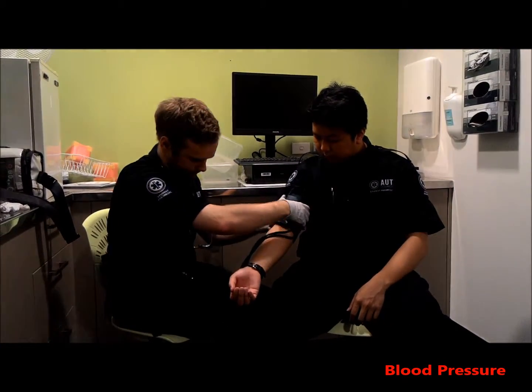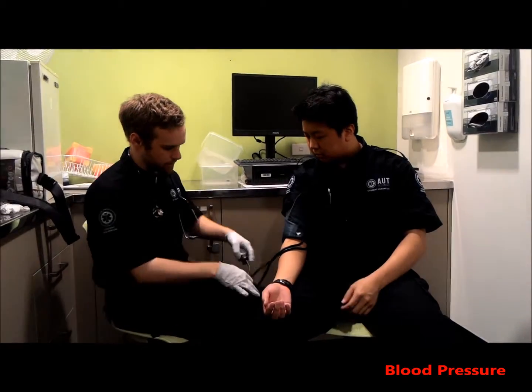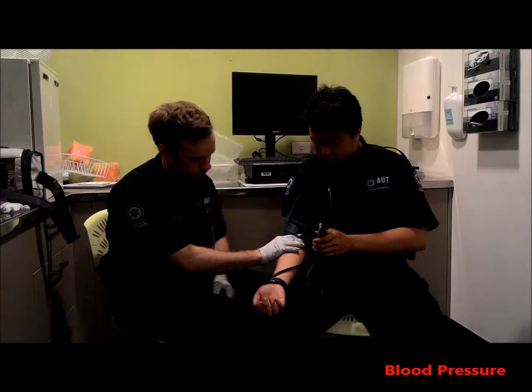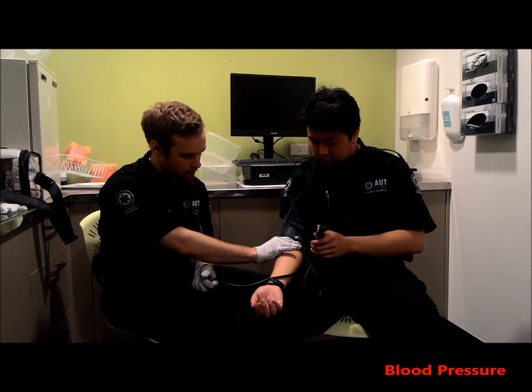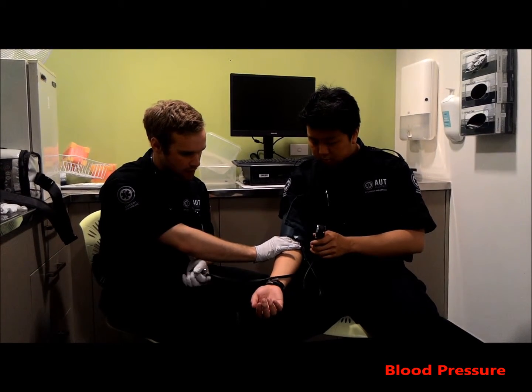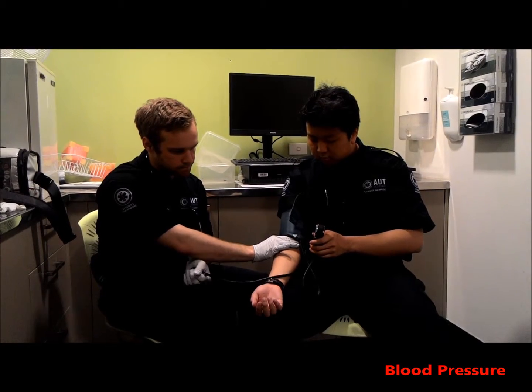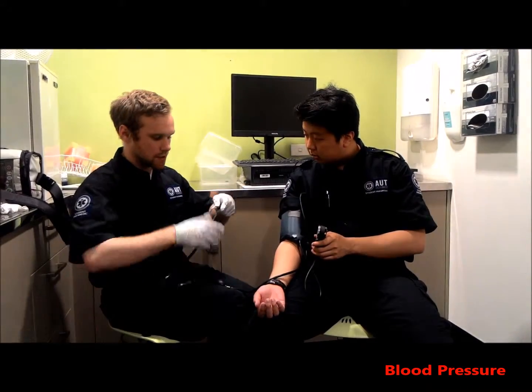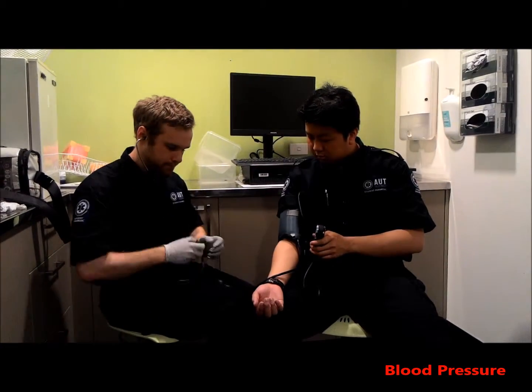Is this comfortable? Yeah. Just get you to hold this. Next, you want to find the brachial pulse. We're going to inflate the cuff. And so I can no longer feel this pulse. So I want to place the stethoscope on top of the brachial pulse.